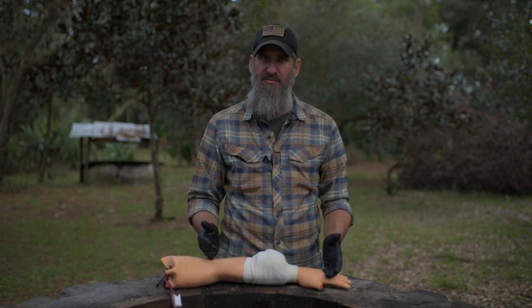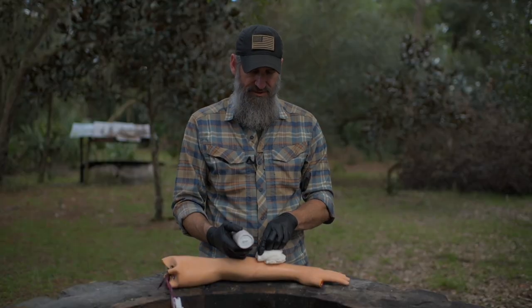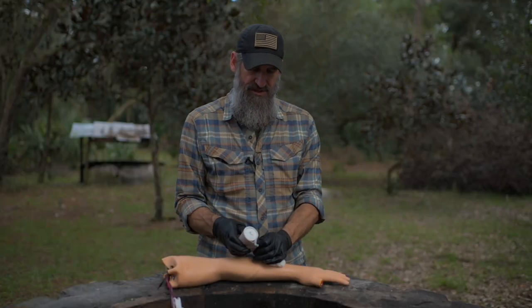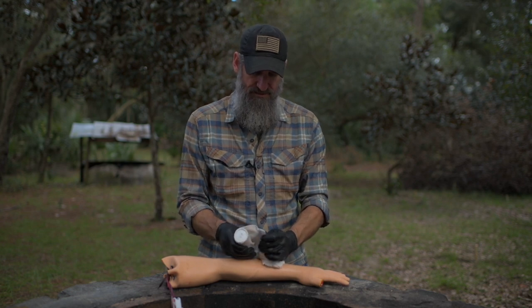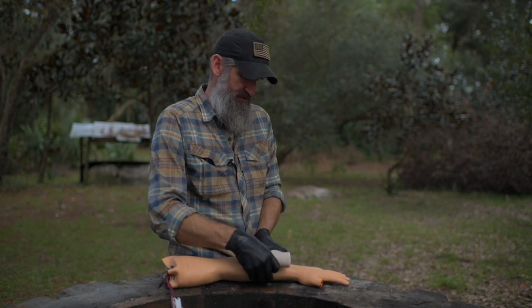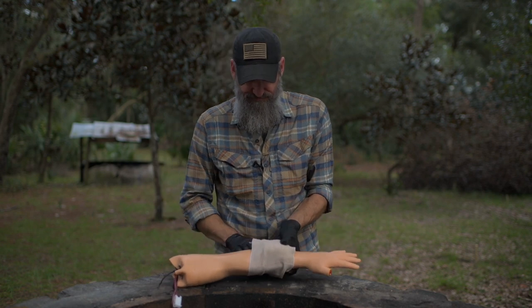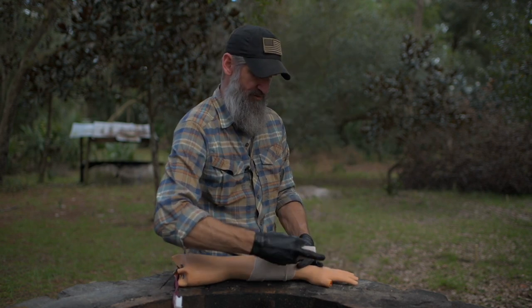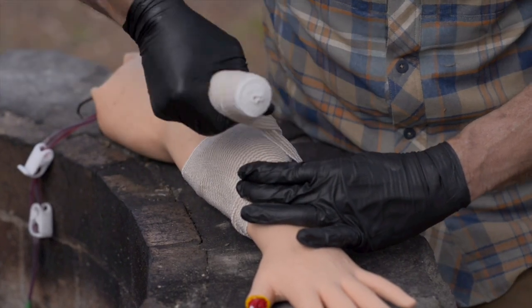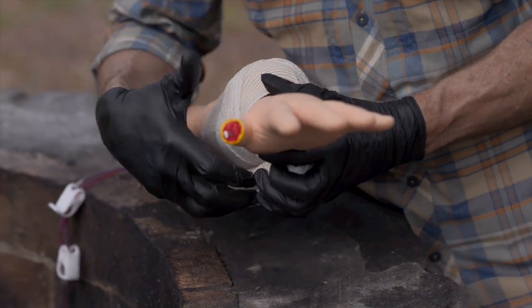The same principles apply. If you don't have an Israeli dressing and you don't have an emergency trauma dressing, you can improvise using just a simple elastic bandage or an ACE wrap, still maintaining that pressure, and you're trading out pressure from this bandage with the pressure you placed on manually with your hand. You'll bring that around at least one full time. As you come up over the dressing, twist it just like we did before, and you want that to cross directly over top of the wound.